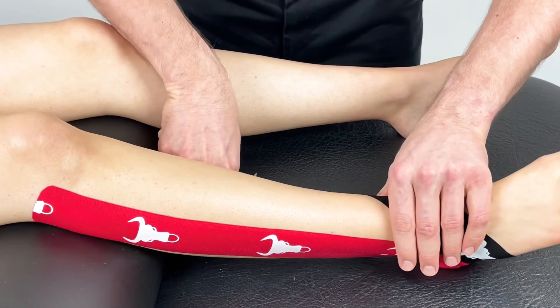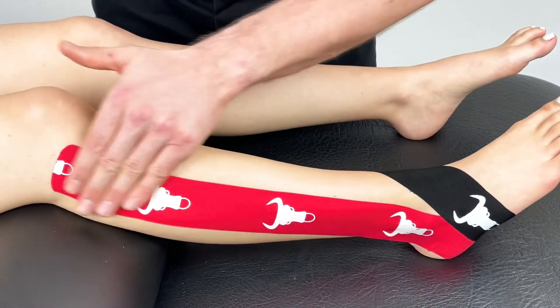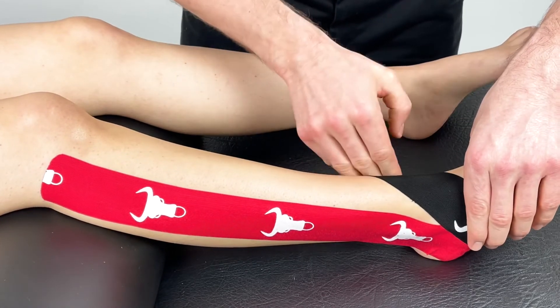Once in place, rub the tape to help activate the glue for better adhesion.